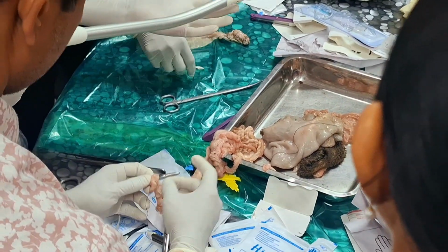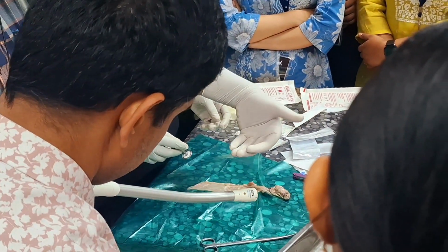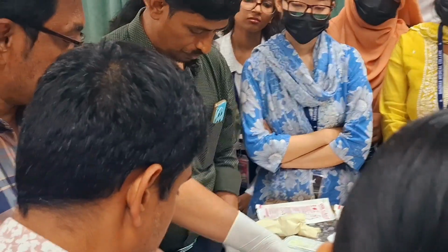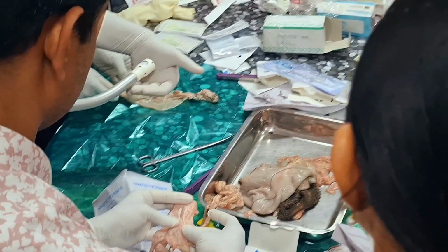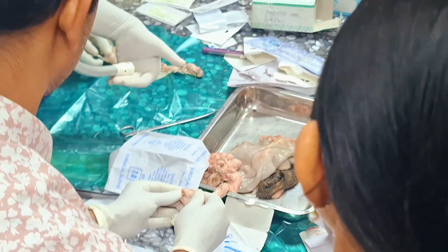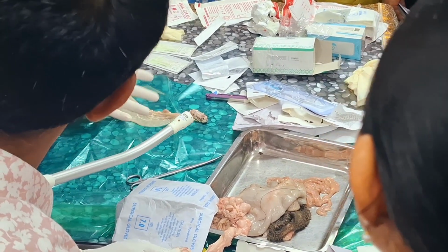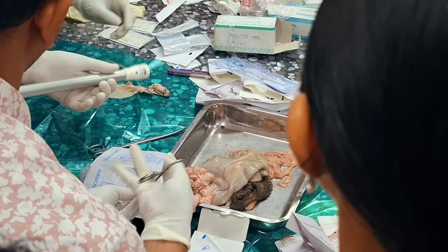Why is it curved? Because usually we use it in gastrointestinal and colorectal surgery. And how is your pelvis? Second promontory, then comes the sacrum, then comes the coccyx. The anatomical position of the coccyx is always above and under. So if you have a straight stapler, it will not go. So to maintain that curvature of the pelvis, you go along the coccyx, hit the sacrum, and turn back. That is the use of a curved stapler, which is good especially in the pelvis. Straight staplers you use for gastroesophageal anastomosis, where curvature is not needed, it's a straight part.